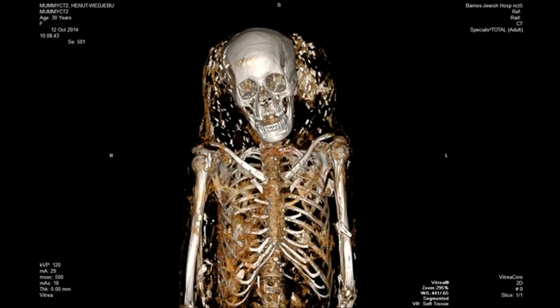Are there any special precautions or considerations you need to take when you're planning to scan a mummy versus a person? Well, it was a very interesting experience because one of the biggest things that we had to grapple with was trying to make sure that the mummies would fit in the scanners. The scanners have a very limited diameter, and though we've got some experience with imaging patients with all different dimensions, it was the first time that we had ever put a sarcophagus inside of a scanner. The whole thing. You didn't take the mummy out of the sarcophagus? Well, two of them came out, yeah, and one of them was left in the casing. The last one that we did had this very regal wooden casing with painting on the sides, and it was really something spectacular to see in person.